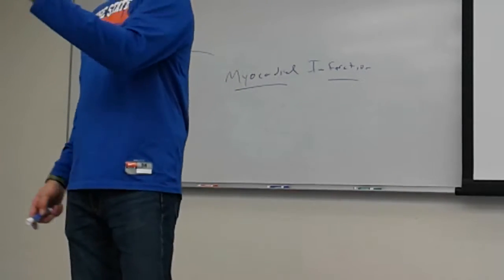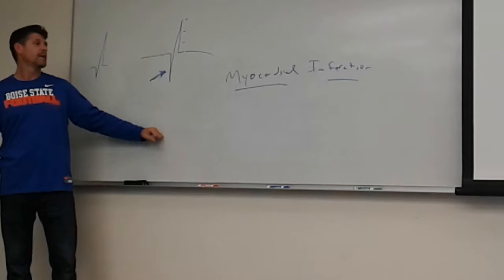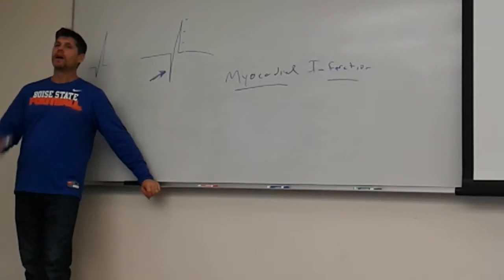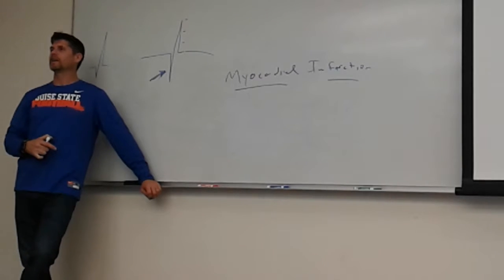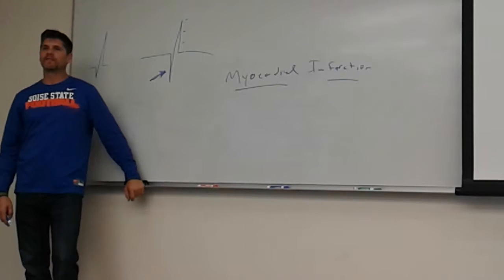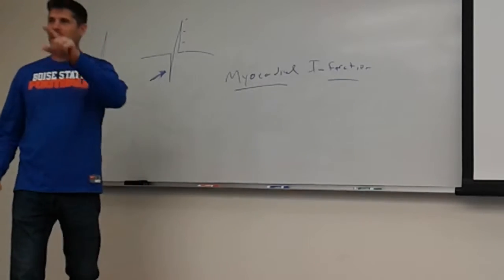But they can absolutely tell, because we can see not only that they had a heart attack that did result in death, we can tell where that death happened by seeing the Q waves. But we wouldn't be able to see when that portion of their heart died. We couldn't give a time to it based on Q waves. We can just tell that it is there. Unless you have serial EKGs, EKGs over and over again.